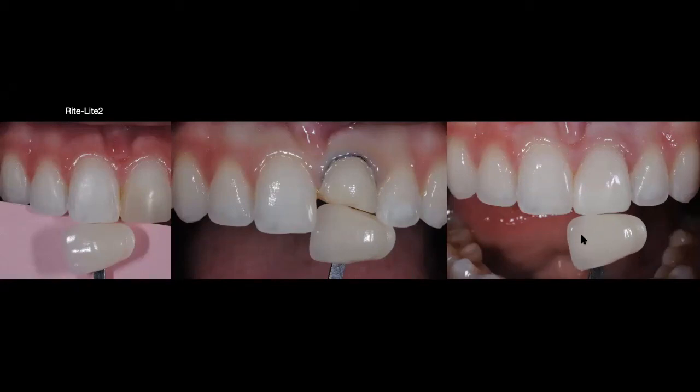Oh my gosh, I can't believe that I forgot. Okay, so with the shade tab that I selected, that I used to select that composite. Now this is the Vita Classic shade tab that I'm using right next to the tooth, right next to my composite. They don't perfectly match, but this is how I select my composite shade.